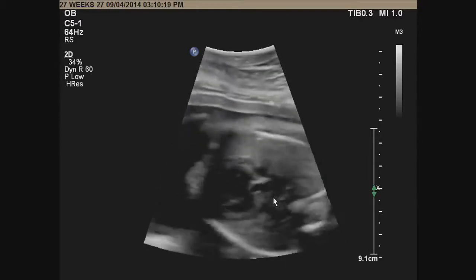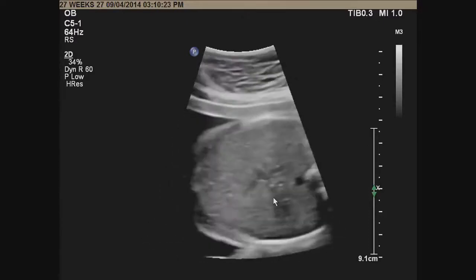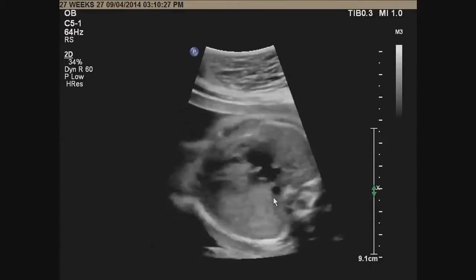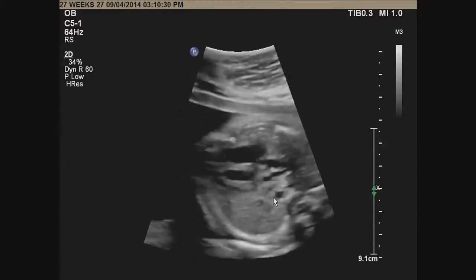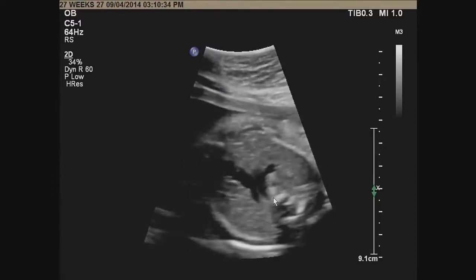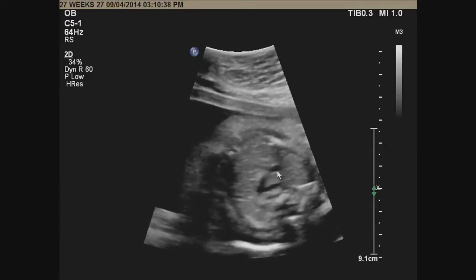And so it's really important when you look at the heart, whether you're doing screening or you're doing your echo exam, that you look at all these important structures around, because it can give you a lot of suspicion for the presence of an abnormality here. And here you actually see the brachiocephalic vein dumping into the superior vena cava.